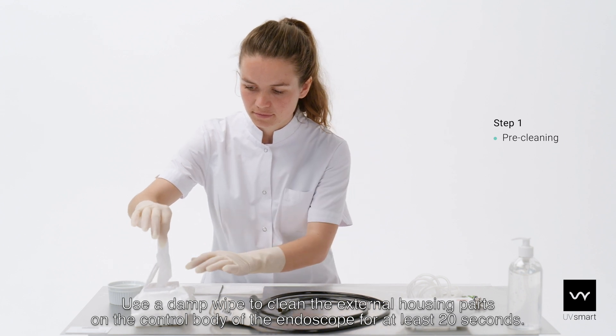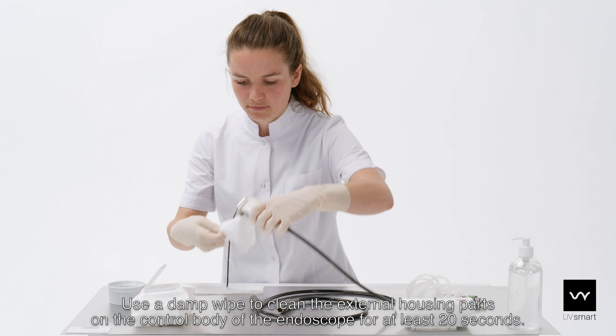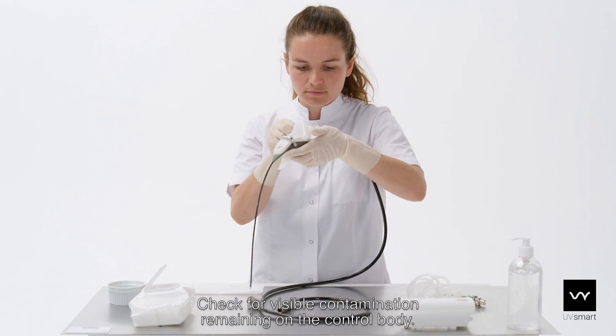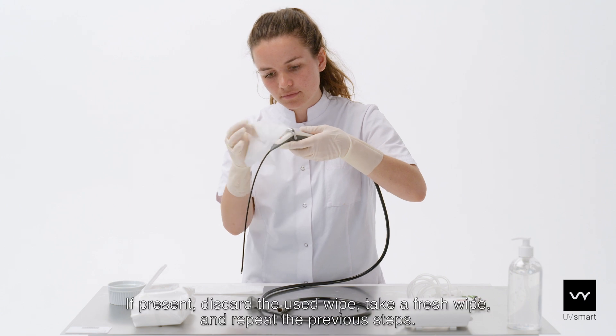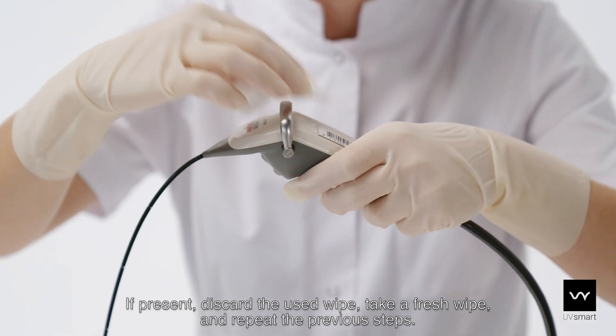Use a damp wipe to clean the external housing parts on the control body of the endoscope for at least 20 seconds. Check for visible contamination remaining on the control body. If present, discard the used wipe, take a fresh wipe and repeat the previous steps.